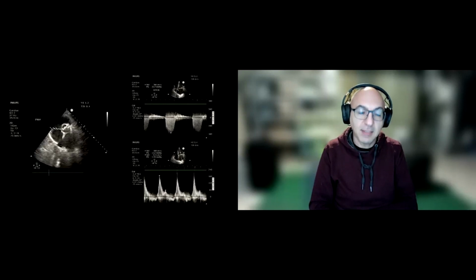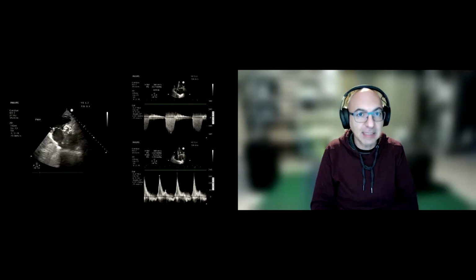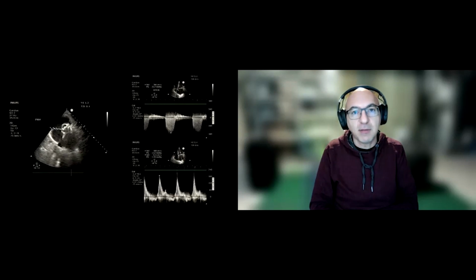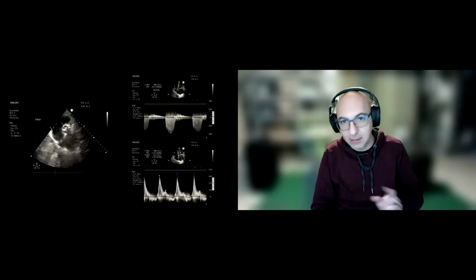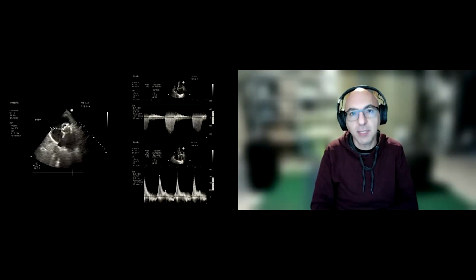Great. And it happens. You intubate the patient, especially folks who have a reason to develop atelectasis or airway obstruction, or maybe the PE that nobody wants to think about, and suddenly the RV stops working. And that is going to put a lot of pressure on the septum. The RV to LV ratio in this person was about 1. The septum wasn't flattening, but imagine if that septum flattened out. That will make preload, filling pressure even higher.